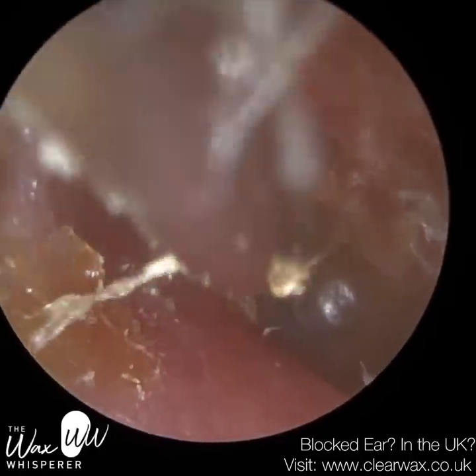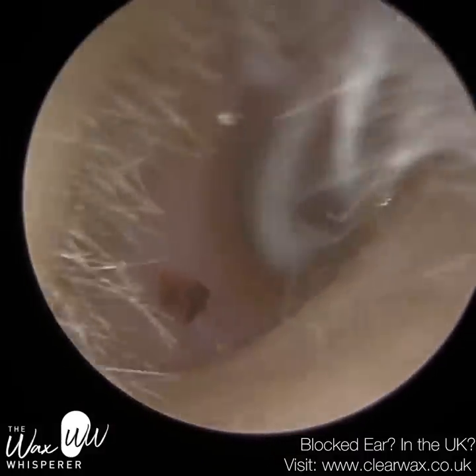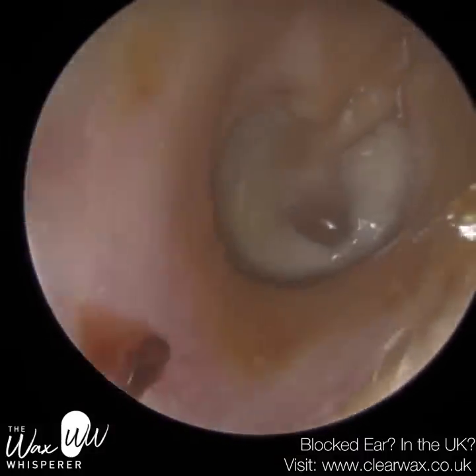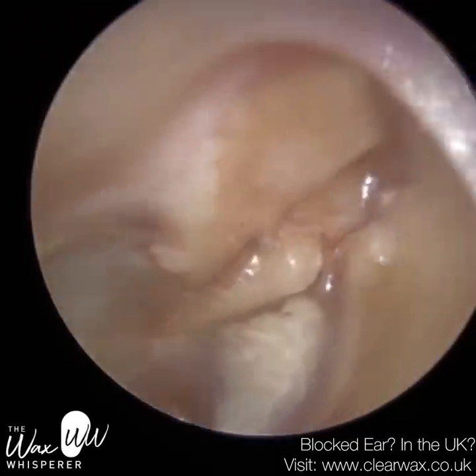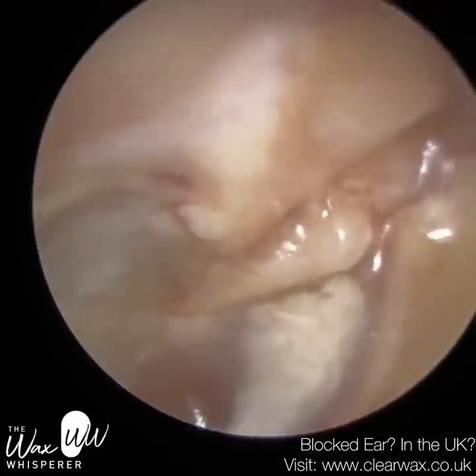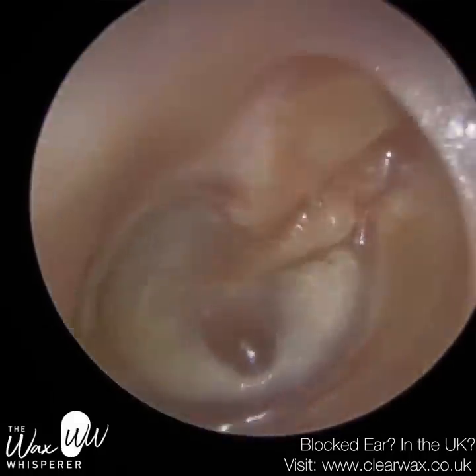This patient has been advised to avoid water in the ear just in case there's a perforation centrally where that dead skin was. And this is the right ear — you can see at around 11 o'clock, that's the cartilage graft. The attic region has been drilled away; that's where the cholesteatoma can form. There's some tympanosclerosis — scar tissue anteriorly at 3 o'clock — that's the white patches there. But this is disease-free, so it's great news for the patient.